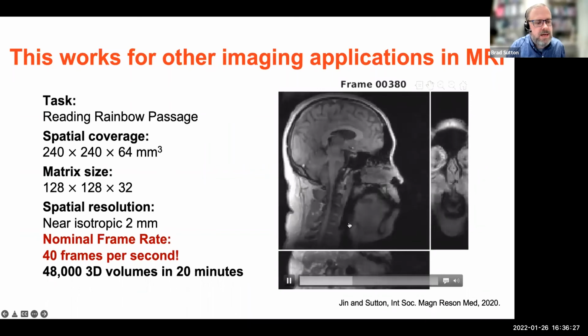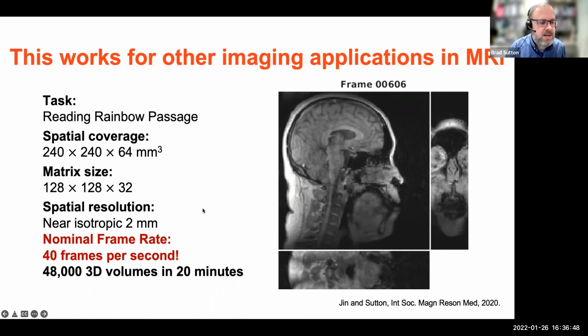We're able to make measurements of how things are moving and be able to see the full three-dimensional structure, dynamic structure in all these directions. So we're covering 10 times as many slices as we started with. We're able to get up to 10 times faster. This is 40 frames per second, but we're able to go much faster than that. And the quality of the images has actually gone up quite a lot too. So these are almost order of magnitude in 3 domains improvement over the way we were doing things before.